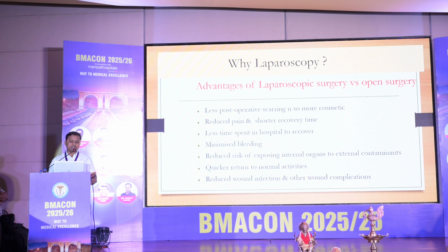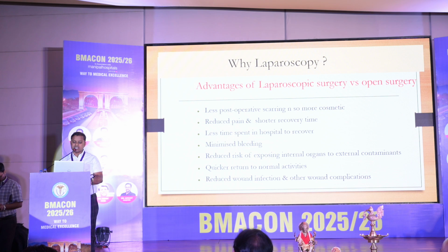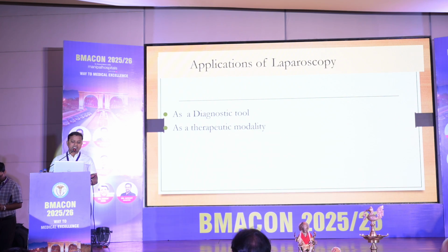Now, why laparoscopy? The advantages of laparoscopy: less post-operative scarring, so more cosmetic, reduced pain and shorter recovery time, less time spent in hospital to recover, minimized bleeding, reduced risk of exposing internal organs to external contaminants, quicker return to normal activities, and reduced wound infection and other wound complications. Applications of laparoscopy: it can be used as a diagnostic tool or a therapeutic modality.